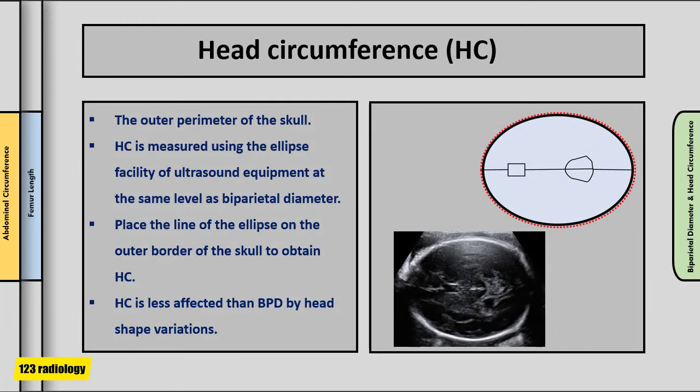Head circumference is the outer perimeter of the skull. It is measured using the ellipse facility of ultrasound equipment at the same level as the biparietal diameter, placing the line of the ellipse on the outer border of the skull. Head circumference is less affected than biparietal diameter by head shape variations and fetal presentation, and is therefore preferred as a more valuable measurement in assessing gestational age.